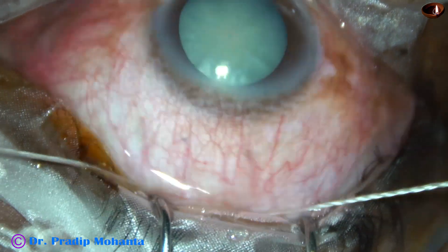Now some lens matter is to be removed. I am using a 23-gauge Simcoe to remove the lens matter. In this case, the cortex is not coming well — probably because of the positive vitreous pressure, it's not coming well.